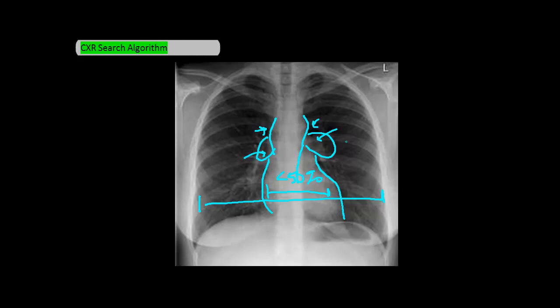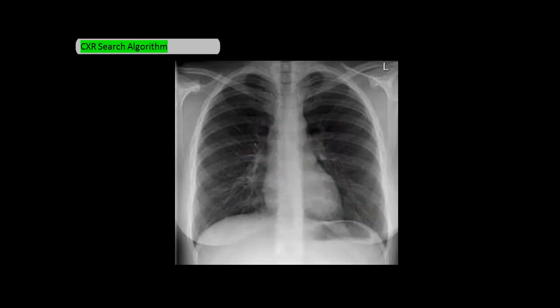Now let's talk about D, or diaphragm. The two diaphragms should be sharp, as I'm drawing out here, and you want to look underneath the diaphragm to see if there's any air — if there is, you'll see an area that's darker than in this film. The right diaphragm is normally a bit more elevated than the left, and that's normal. You just want to check there isn't extreme asymmetry between the two. You should also be able to see the air bubble inside the stomach, which is right here.